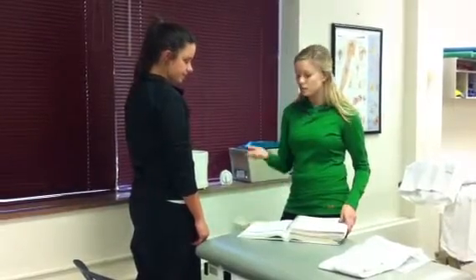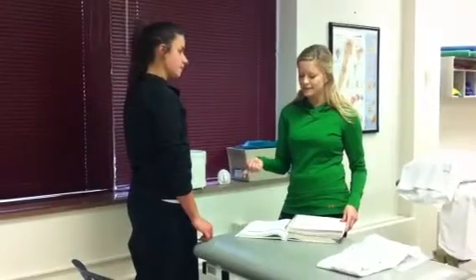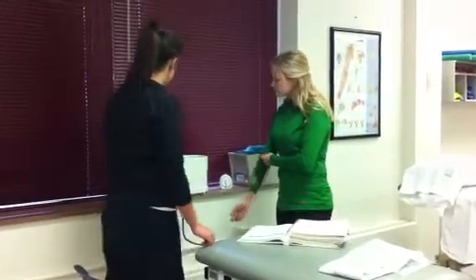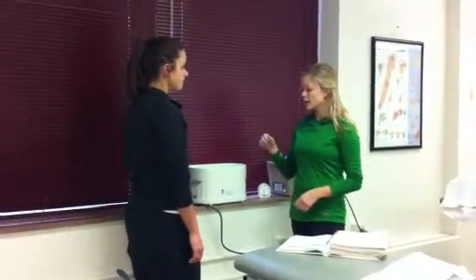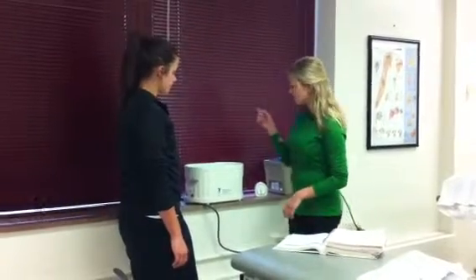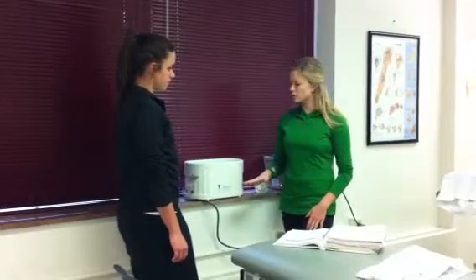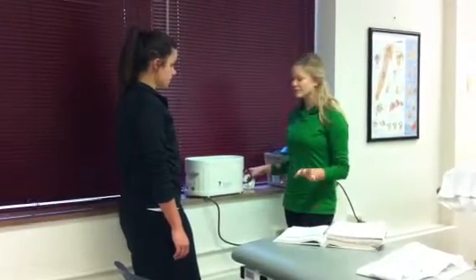Since we've checked all that, you would have your patient remove any jewelry and wash her hands, which she's already done. There are two methods. The first method, you would have her dip her hand and bring it back up and let it dry, then dip it back in and leave it there for the duration of the therapy — 20 minutes. We'll go ahead and do that, but we won't leave it for 20 minutes.